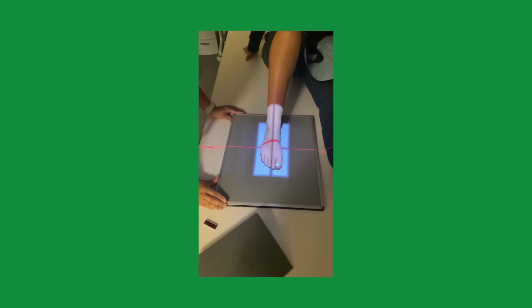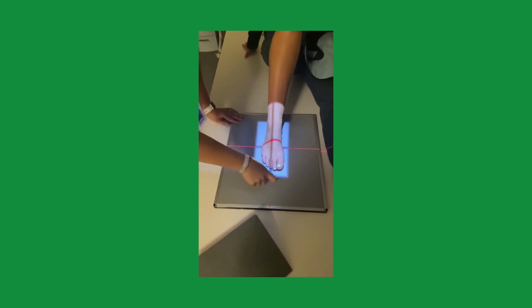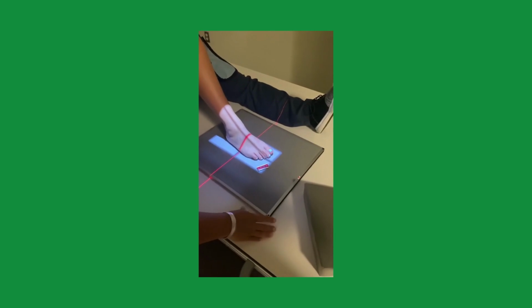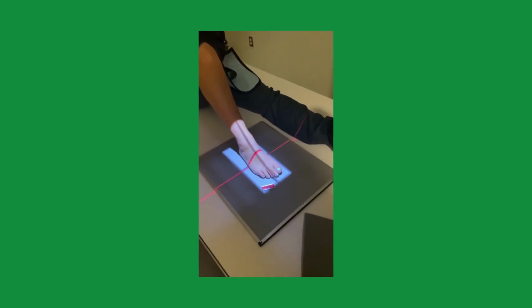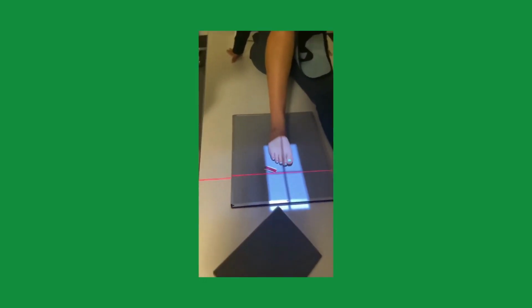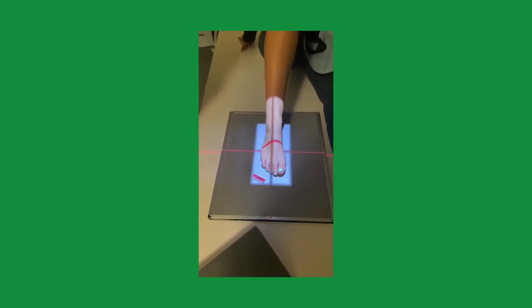So I'm going to move just a little bit here. Make sure that you have light off the toes and through the heel. Make sure that there's no rotation in the leg, and your marker's on the lateral side. I'm going to take my angle off for my oblique. I'm going to have my patient roll in.